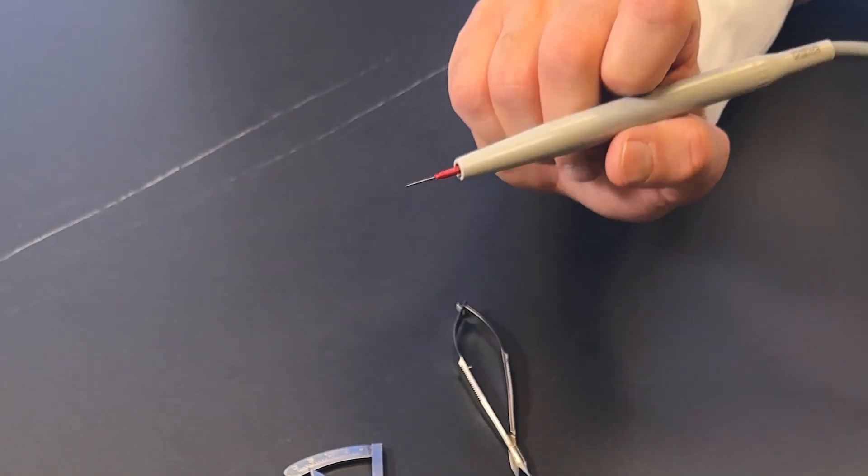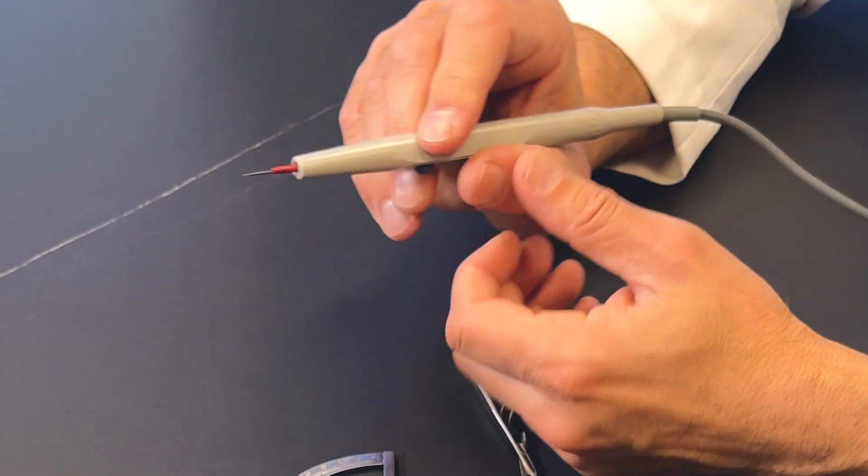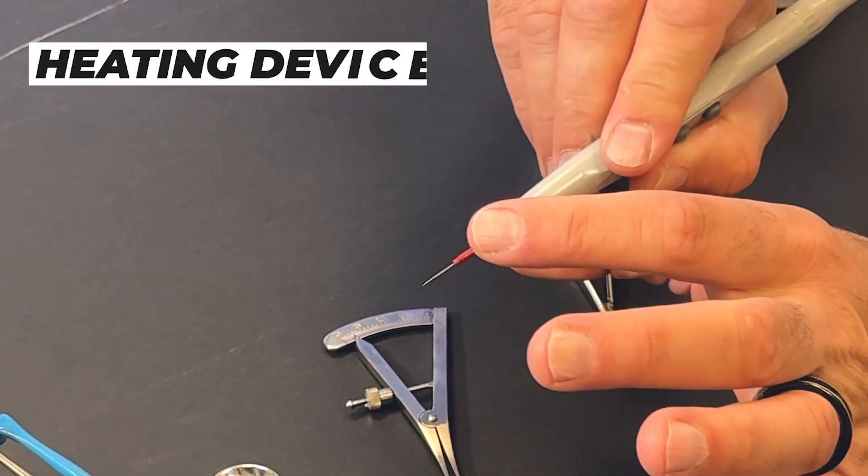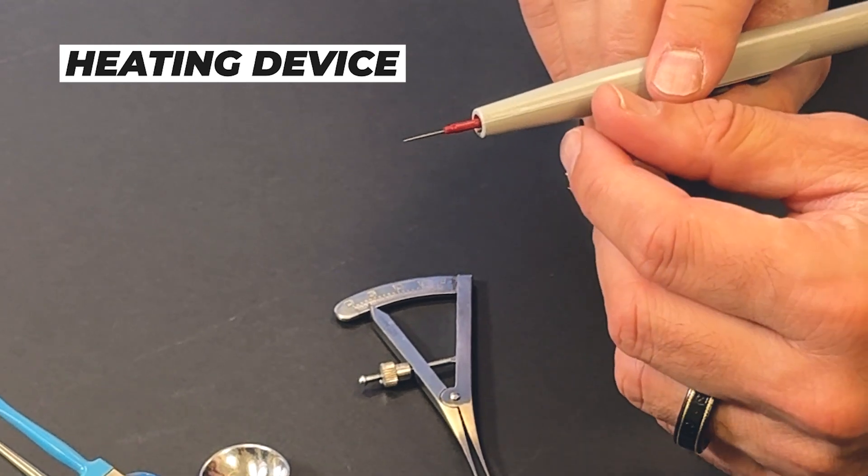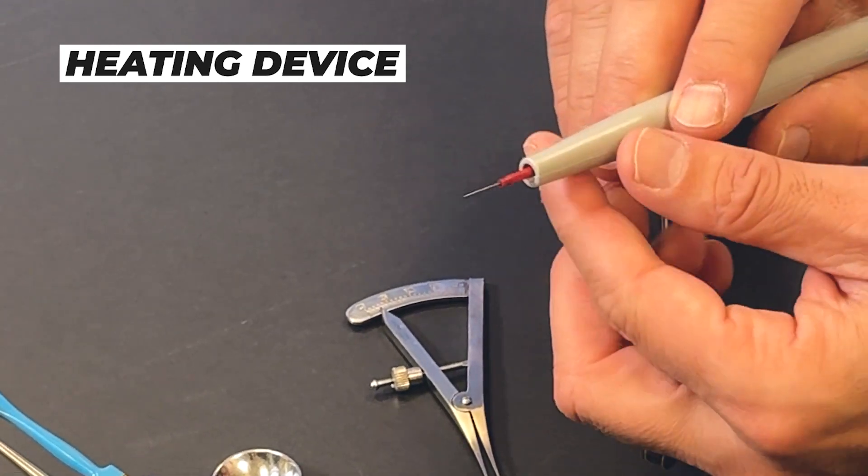How do I trim fat? I generally use a heating device. If there's bleeding, I use a heating device. This is a very fine needle tip that gets heated, and I use it carefully to shrink blood vessels or if I need to remove some fat or shrink some fat. It's a Colorado needle tip, very standard in microsurgery or plastic surgery, oculoplastic surgery.